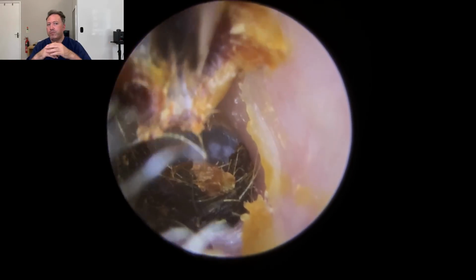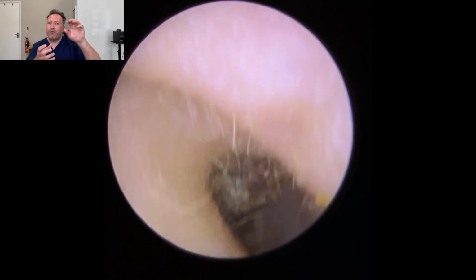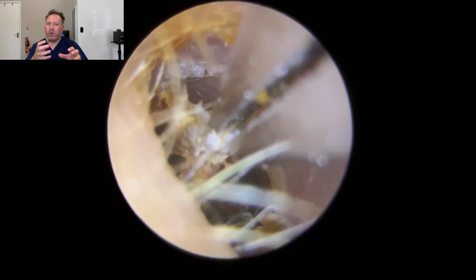Pull this down, which is what we're doing here. Look how stretchy this is. It's pulling that dry, dead skin with it underneath as well, where it's all dried onto the canal. Now if we can get a grip on this section, we'll use the crocodile forceps again. I'm hoping that it's going to take the whole thing out in one big corkscrew.